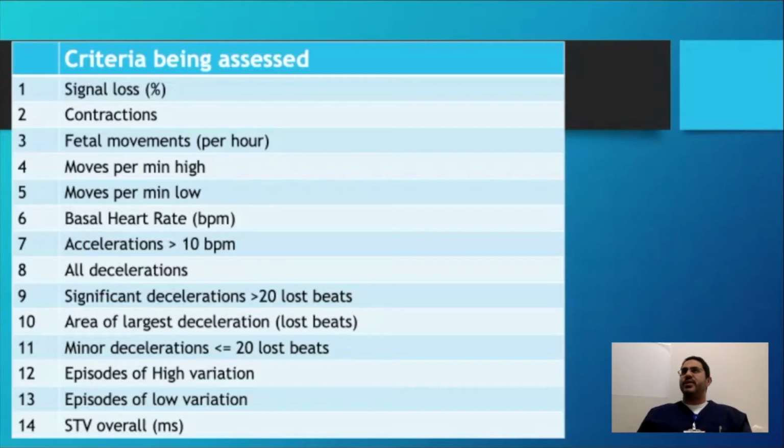So once again, who can assess the baseline? A, the machine can't even give you a correct number. B, it doesn't even know where it's supposed to be. So again, it is you, not the machine.